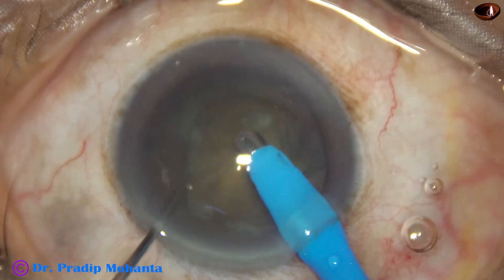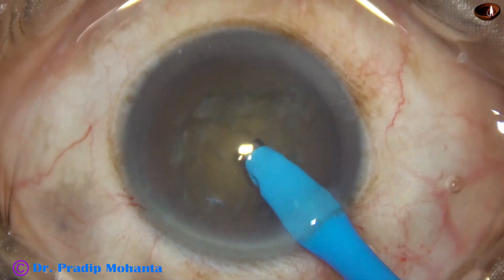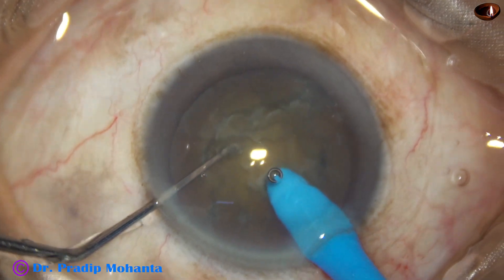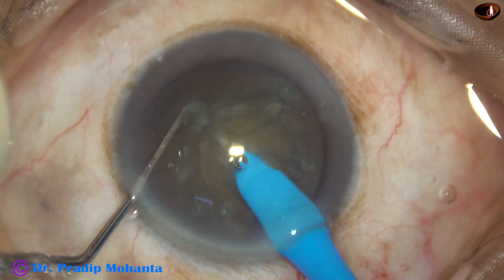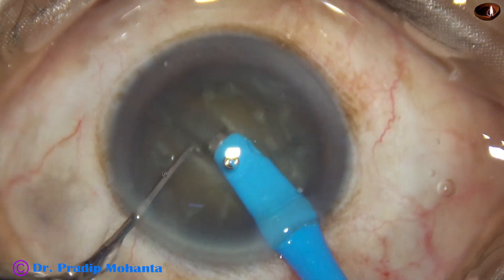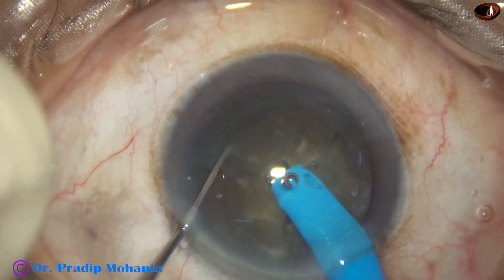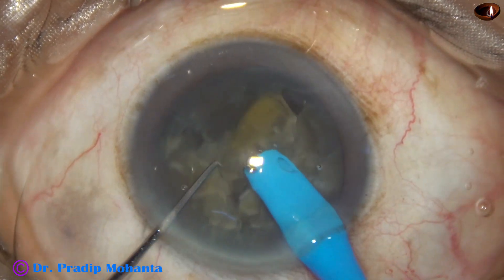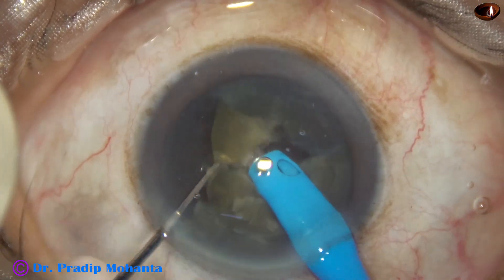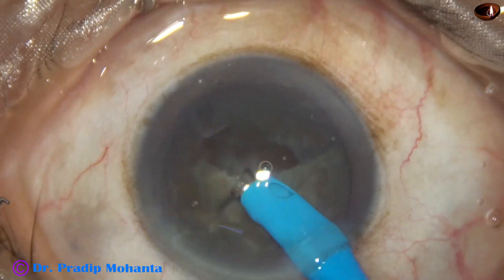Now see the direct chop — some superficial lens matter is removed. The tip is buried into the substance of the nucleus, it goes through the nucleus for some distance, and then the nucleus is chopped. Rotate the nucleus 180 degrees, and now this semi-nucleus is held and chopped. This free nuclear piece is emulsified, and then the other nuclear piece is divided into 2 smaller pieces and emulsified.